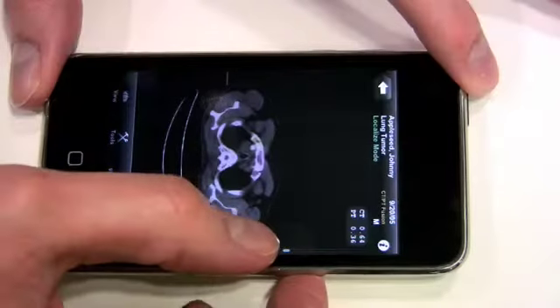One interesting thing I could see in maybe like a third world developing country where they don't have a lot of revenue or money to have imaging centers or personnel to actually do the reads on site, they maybe could have a centralized reading center. Everybody goes there for the scans, and then they could push the data out to experts that may or may not be in the country even.